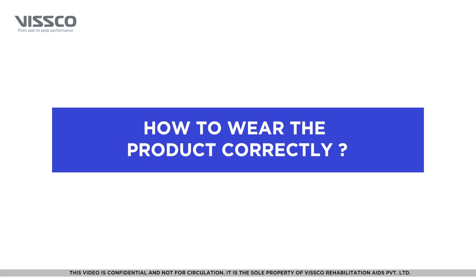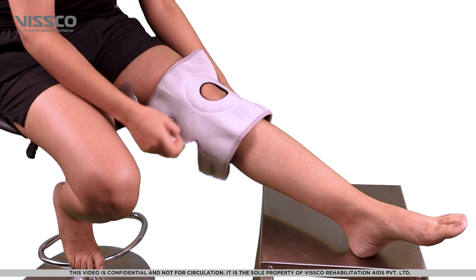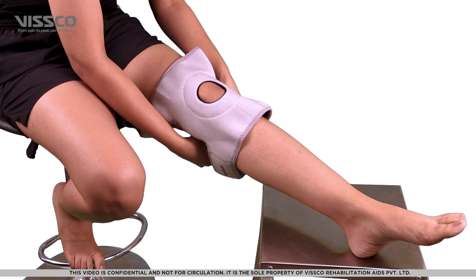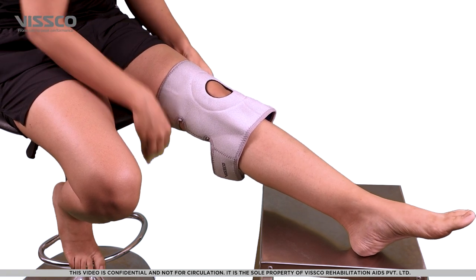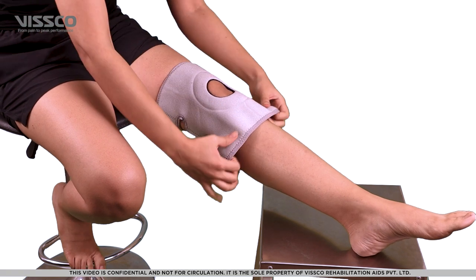Now that you have selected the right size, let's wear the product. Place the support over your knee so that the opening on the support comes over your patella. Fix the support by locking the middle velcro. Now, pull and lock the top and bottom straps so that the support fits comfortably and snugly.